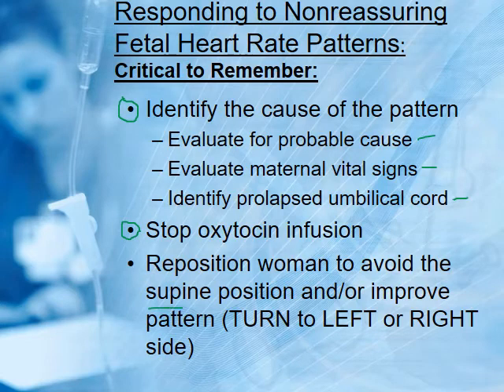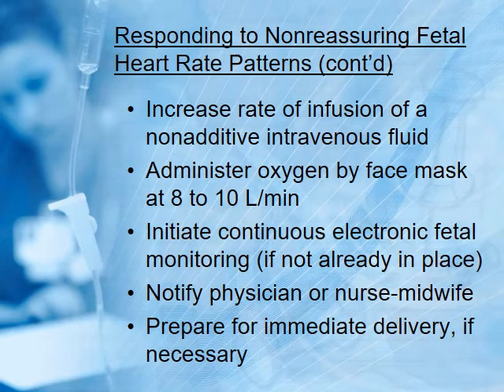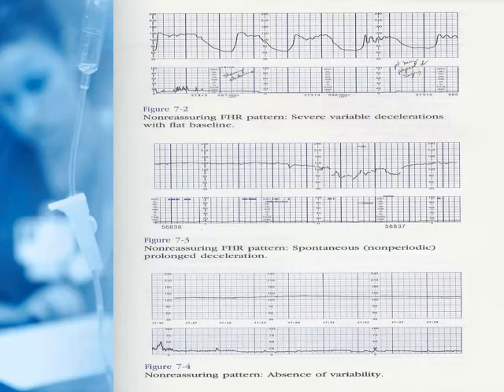And make sure she's not on her back, okay? Increase the IV fluids, give oxygen, initiate the monitoring if not already in place. Notify the physician or midwife and prepare for imminent delivery for these non-reassuring heart rate patterns.